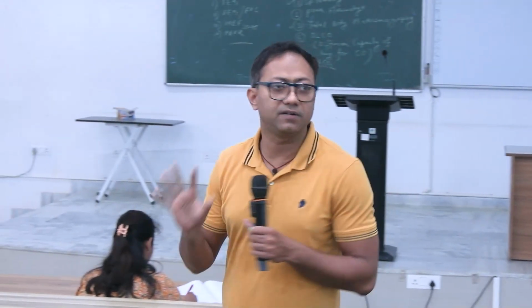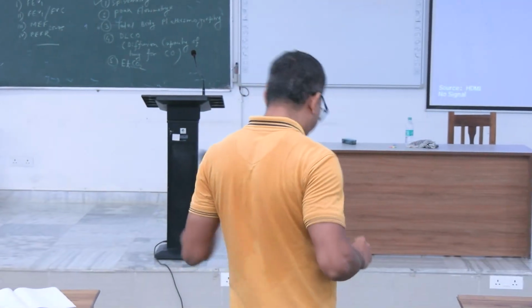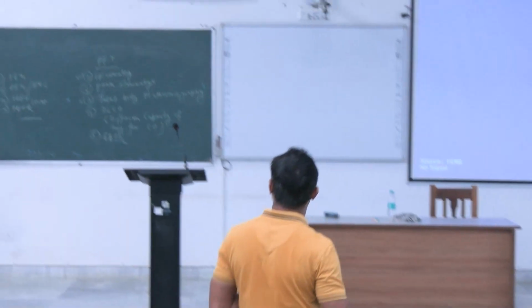But remember, total body plethysmography is most commonly used clinically because it is convenient, and also accurate. So total body plethysmography.